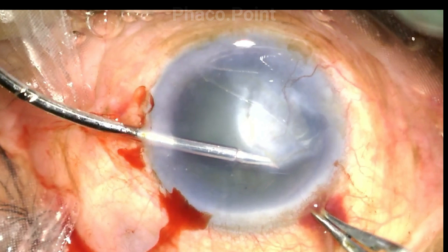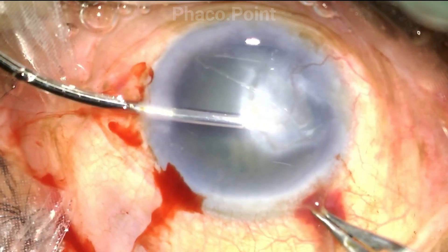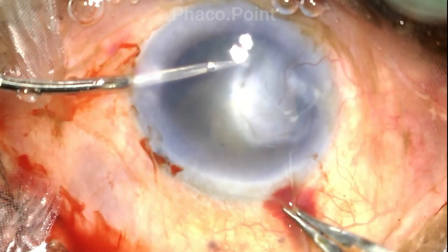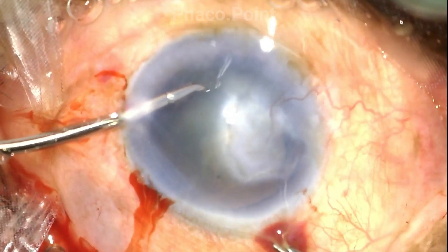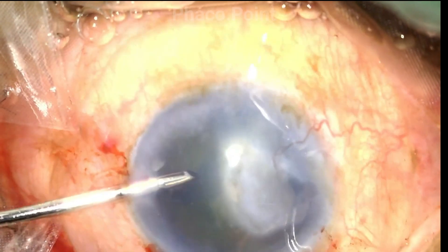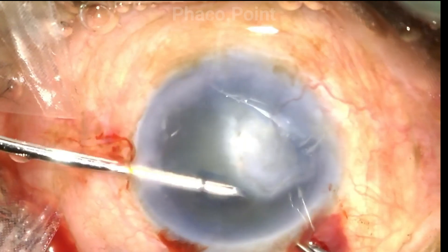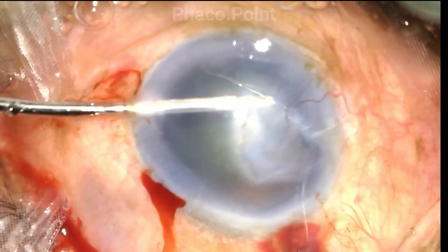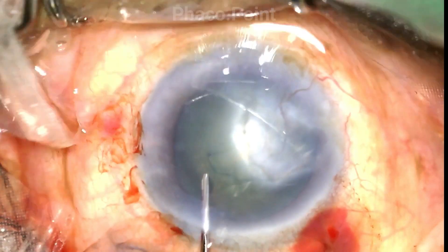Despite not having visibility but having held on to the capsule, you move your hand in a manner that should bring the rhexis around to the point where you actually have visibility, after which you complete the rhexis in a normal fashion. The next step is hydrodissection after removal of some viscoelastic.